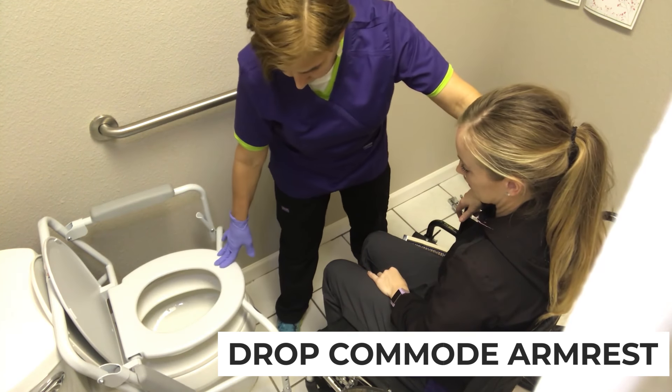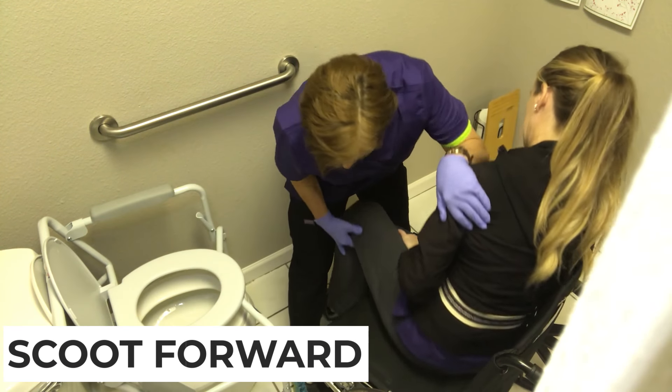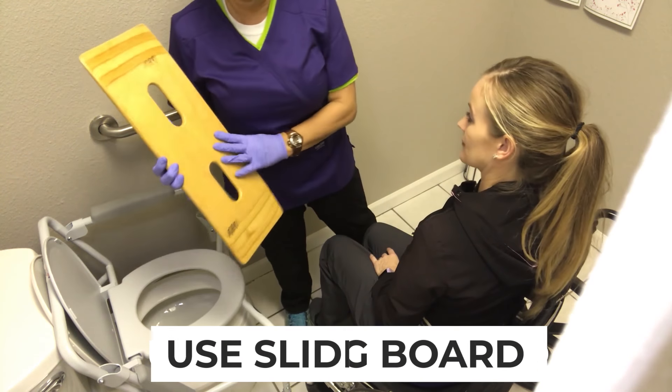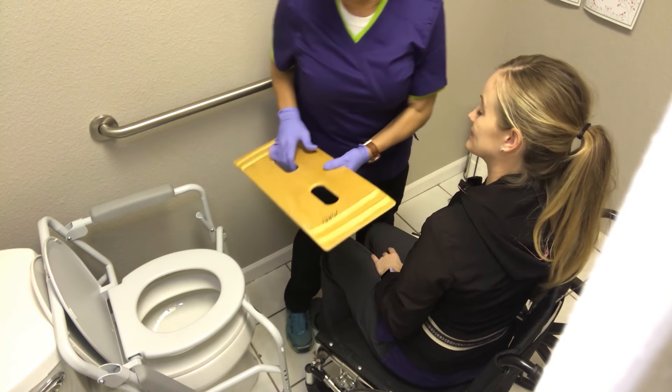We're able to do a smooth transfer without having to stand. I'm still going to scoot them out to the edge because the feet need to be close. We're going to use a sliding board — they come in different lengths and different materials.